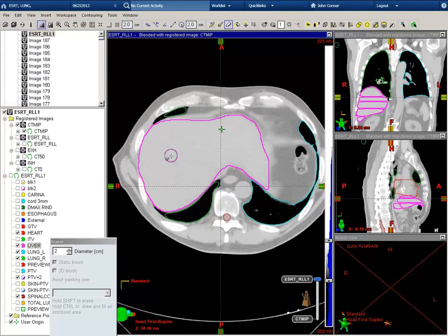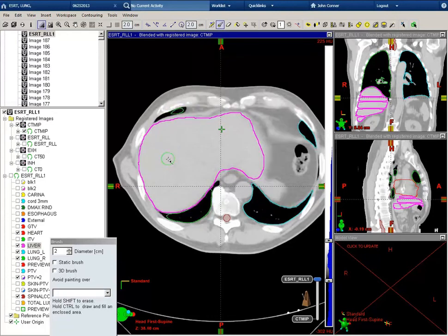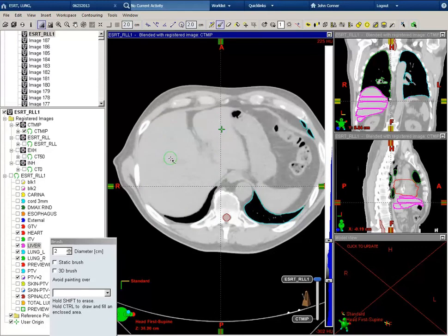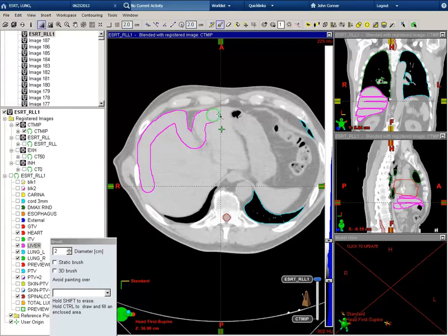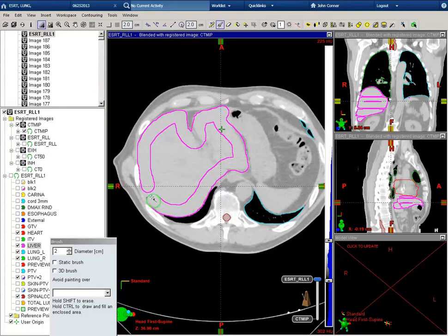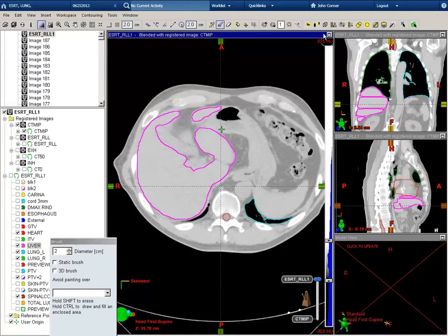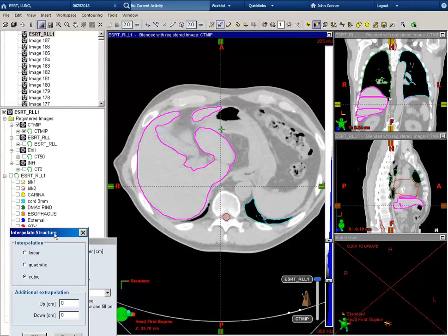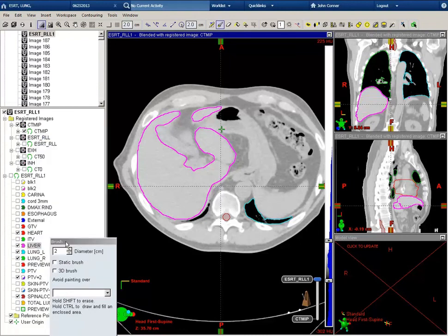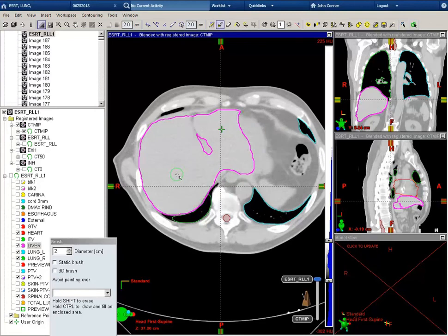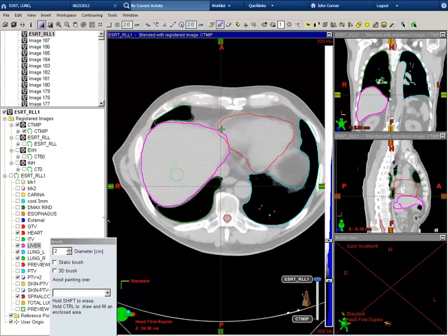Next, let's look at the liver. The liver is here in magenta. I'm going to go ahead and turn on the paintbrush tool and show you how to contour a slice of the liver. I'm going on the outside of the liver, outlining it with the paintbrush tool, making sure to avoid the bowel. The whole time I'm doing this I'm holding the control button down, so when I'm finished it will autofill in this circle. Here on the coronal slice you can see it's not interpolated, so I'll hit interpolate, cubic, and OK. This autofills in between our slices — make sure to look at every slice and confirm the liver looks correct.